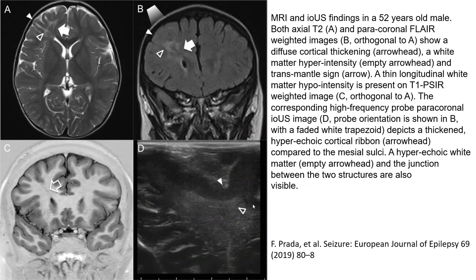This is also the echo image obtained from intraoperative ultrasound. As in image D, we see the hyperechoic white matter, and the junction between the two structures is also visible.